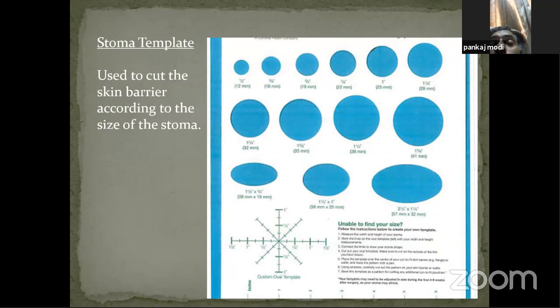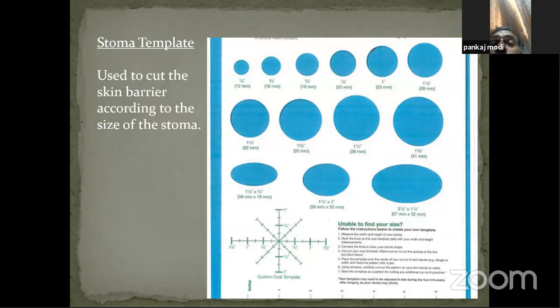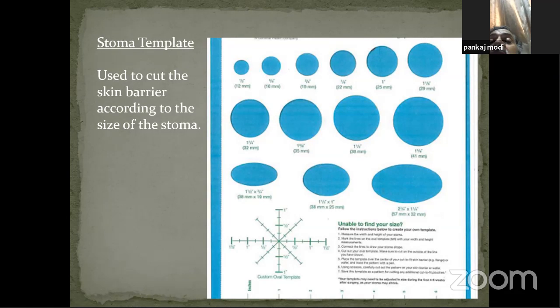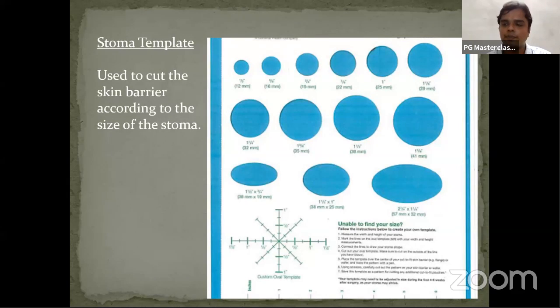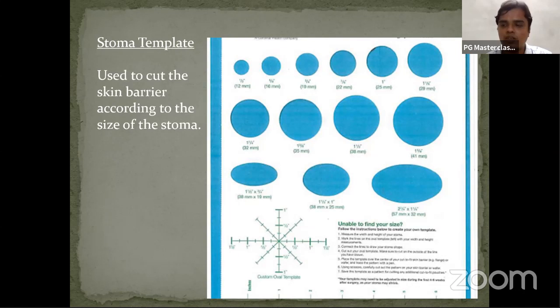One more point. What other thing will be hindering when applying this stoma bag in a temporary stoma? You understand my question? No, sir. The point is that many loop stomas are brought out along with some part of either the feeding tube or that which is covering the loop, which is already attached. Do you understand? Yes, sir. Many times it is like that. So what will you do to that? Sir, in that case, you must have seen.